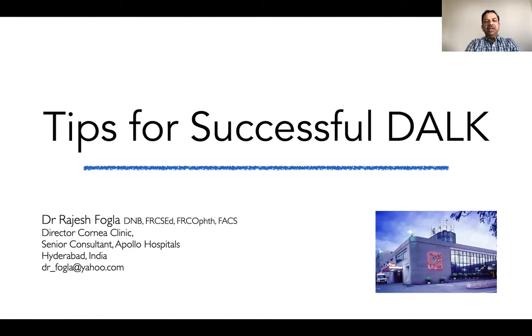Hello, everybody. I shall be talking about tips for successful DALK surgery.